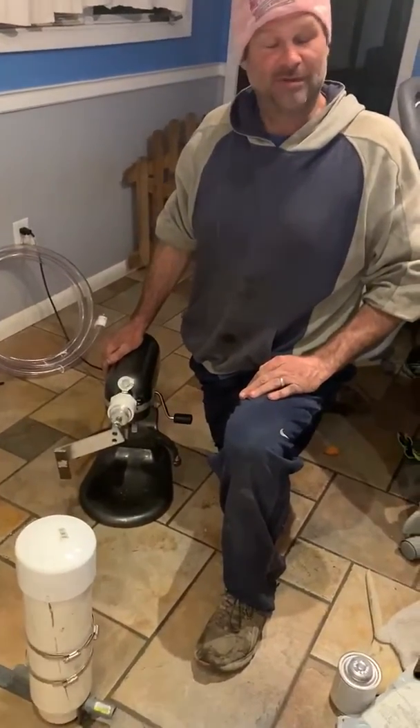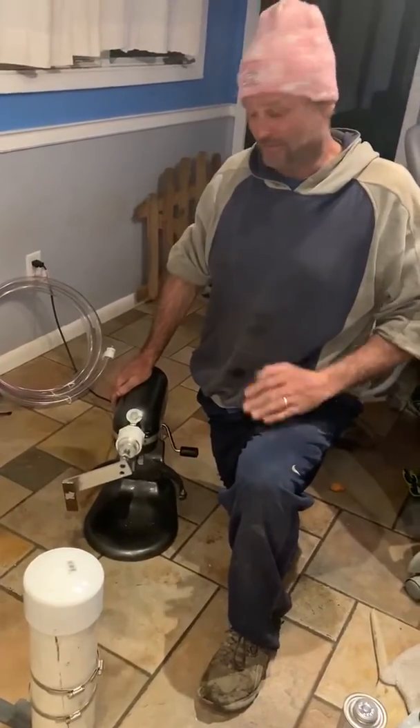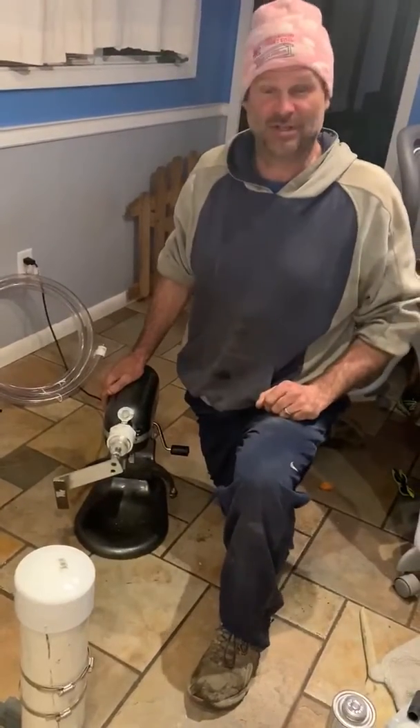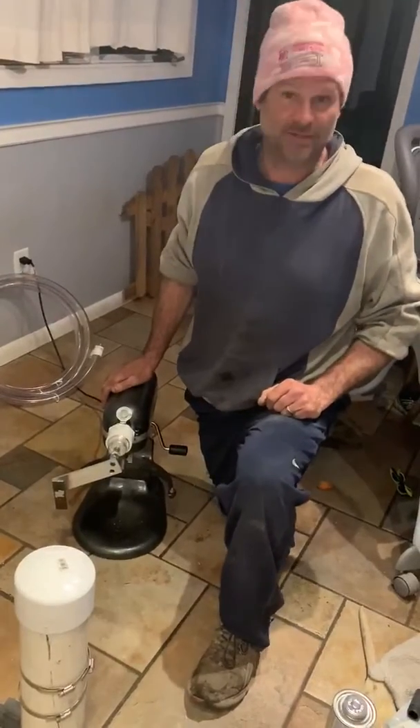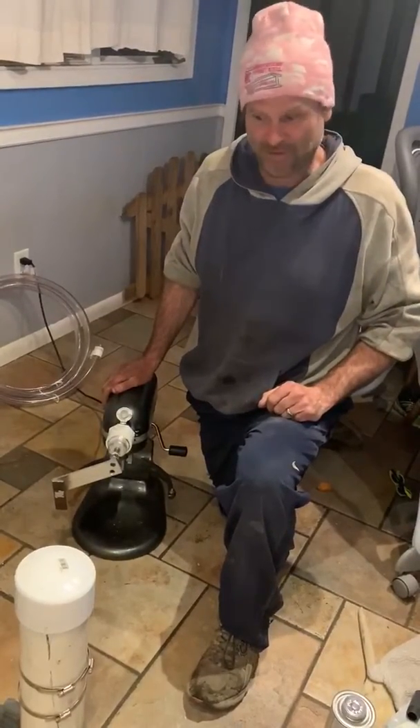This is Frank and I welcome you to another episode of life-saving kitchen devices. This is our KitchenAid mixer prototype ventilator, which seems to be all the rage lately with folks on a ventilator and stuff like that.